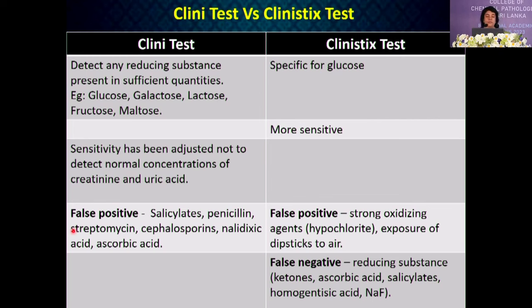For Clinitest, false positives can be caused by various drugs including salicylates, penicillin and streptomycin. For Clinistix, false positives can be caused by strong oxidising agents and prolonged exposure of the strip to air. False negatives for Clinistix can be caused by reducing substances such as ketones, ascorbic acid, salicylates and homogentisic acid.